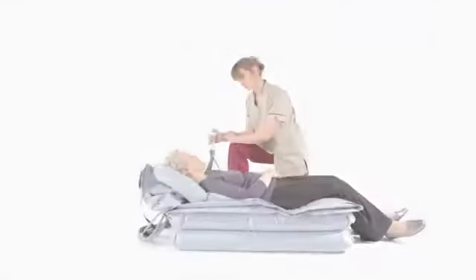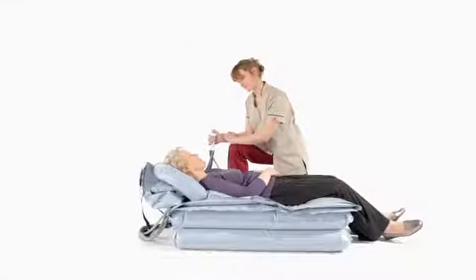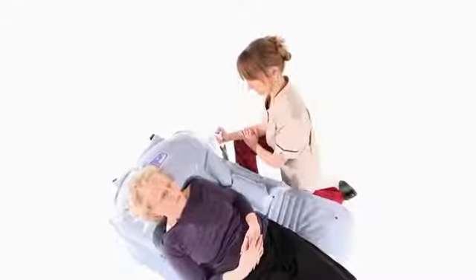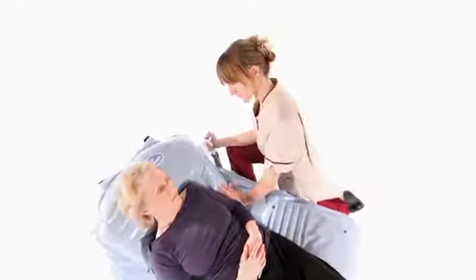Apart from the backrest, it's essential that all sections are fully inflated before moving on to the next. An uneven lift may occur if the person is not positioned centrally on the camel. This can easily be corrected by placing your hand on the opposite side.